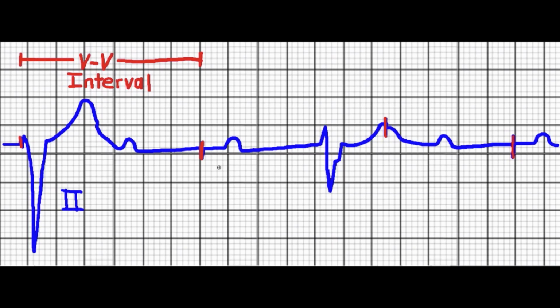So in cardiac pacing, the term failure to capture means the following. Number 1, the pacemaker senses a slow intrinsic heart rate. Number 2, the pacemaker sends an impulse. And number 3, the heart does not respond, i.e. it does not capture. So pacemaker spikes appear, but there's no QRS that goes along with the spike.